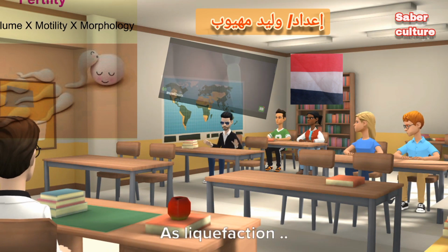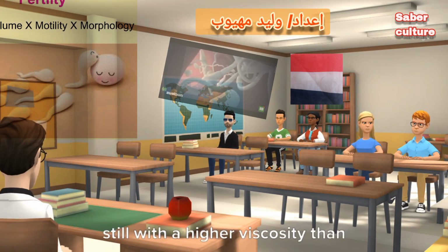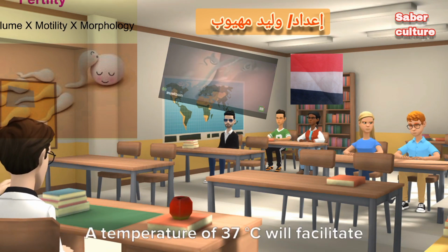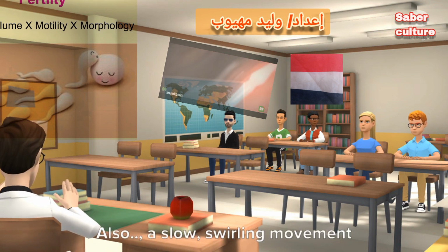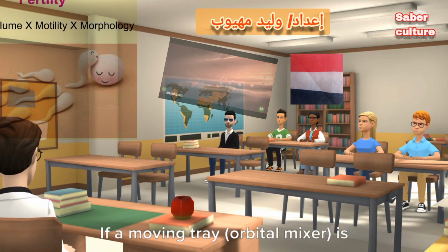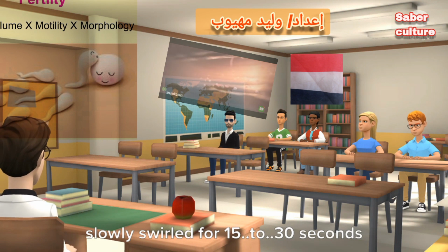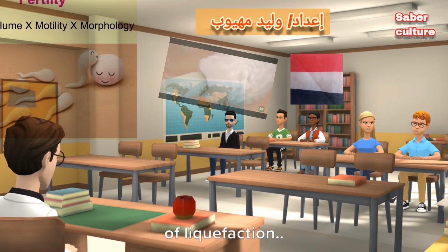As liquefaction continues, the ejaculate becomes more homogeneous and more watery, but still with higher viscosity than water. In the final stages of liquefaction, only small areas of coagulation remain. A temperature of 37 degrees Celsius will facilitate liquefaction. Also, a slow, swirling movement of the sample container will help liquefaction to complete. If a moving tray orbital mixer is not used during the liquefaction, it is essential that the container is slowly swirled for 15 to 30 seconds before starting the microscopic assessment of liquefaction.